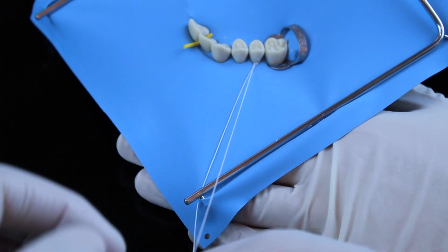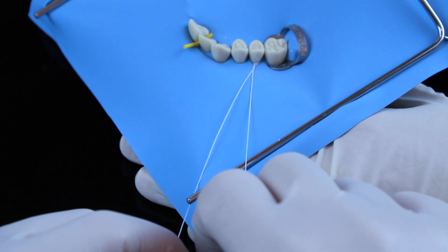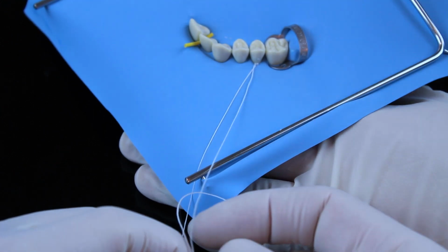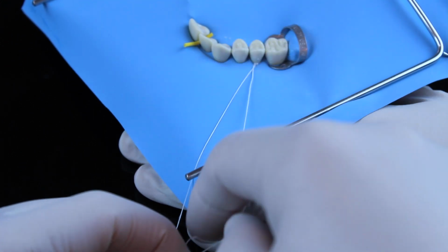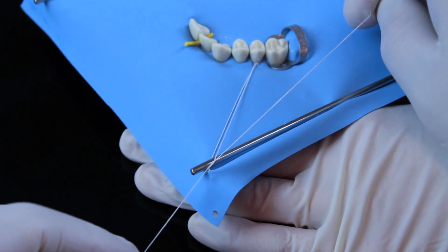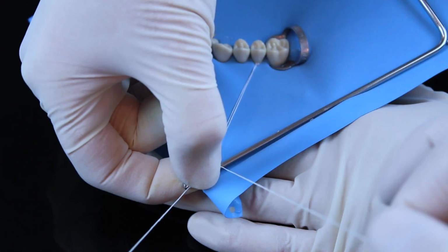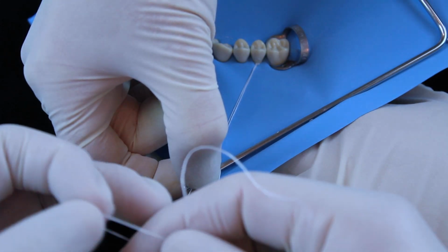The ends of the floss can be tied to the frame if needed, and that will sometimes add retraction. If not, we can just trim it short. This is the easiest way to tie it. Just make a simple knot and tighten it. Your assistant will help so that it won't untie during the tying itself.